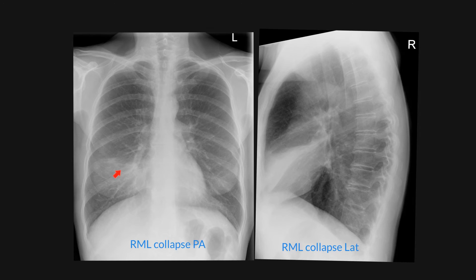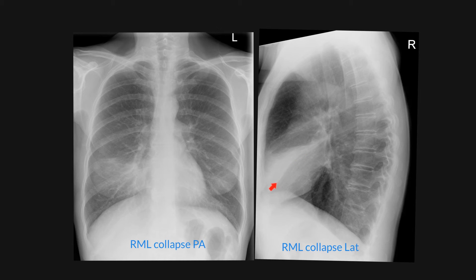This is a patient who has got right middle lobe collapse. You can see that the right heart border is obscured, and there is increased density over the right midzone. The lateral clearly demonstrates that the horizontal fissure and the oblique fissure on the right side have come together, and the triangular density here is the collapse of the middle lobe.